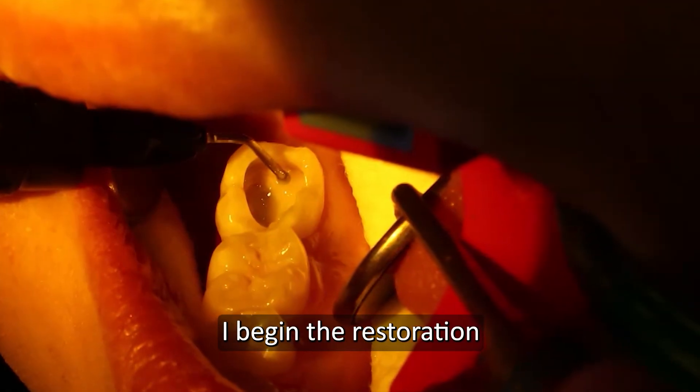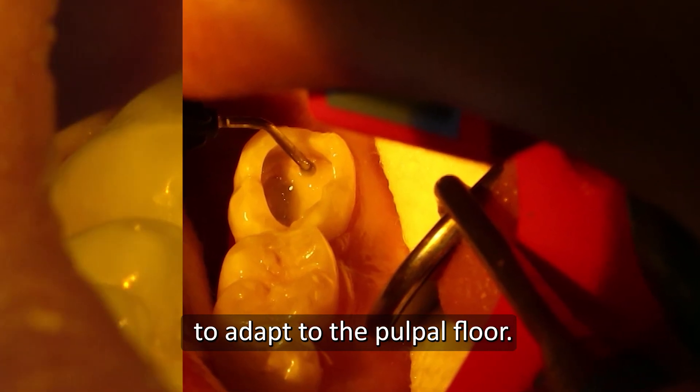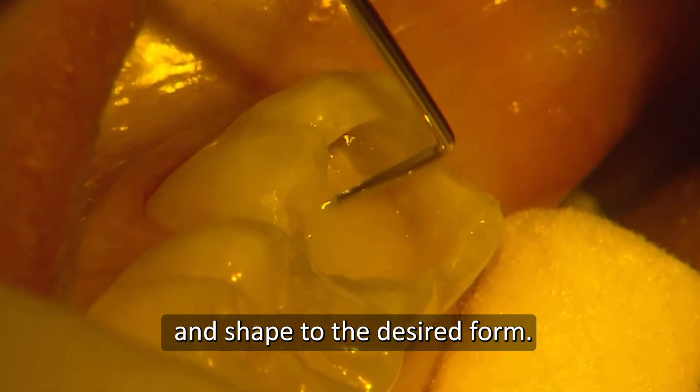I begin the restoration with a thin layer of flowable to adapt to the pulpal floor. Then I build up the restoration with A1 enamel. The material is very easy to adapt to the cavity walls and shape to the desired form.